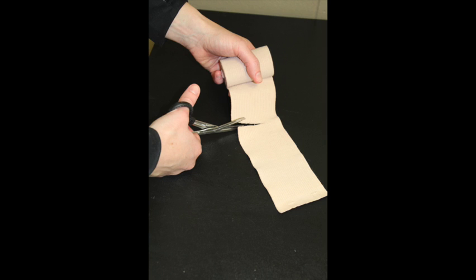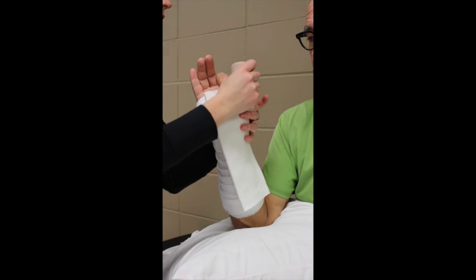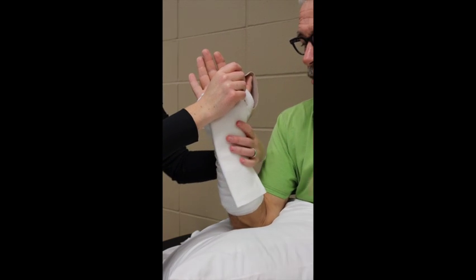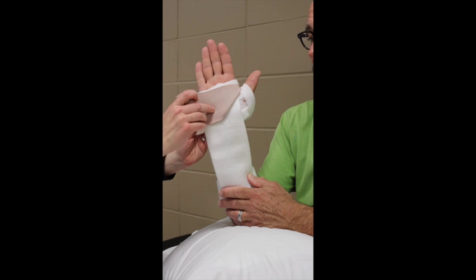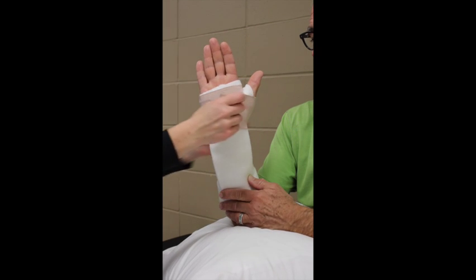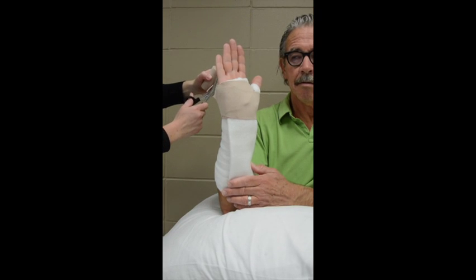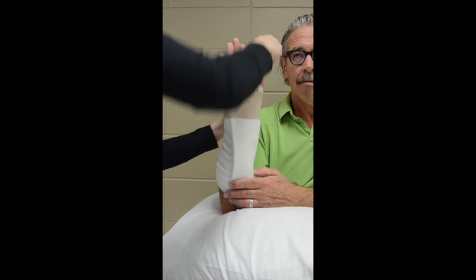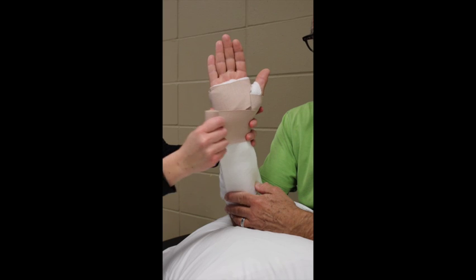Holding the elastic bandage in my left hand, I unroll it a little. About four to five inches in, I make a cut — this will go in the first web space. Place the splint in the palm and volar forearm. Sometimes it's tricky to get everything in place, so I ask the patient to help hold the splint. That cut goes in the first web space. I tend to fold my edges so they don't fray. Tucking in the end, I begin to unwrap the ace wrap with about 50% tension. When I go through the web space again, I make a cut from the bottom and bring it through the web space, avoiding any pressure in the web space as that can cause injury to the digital nerves.